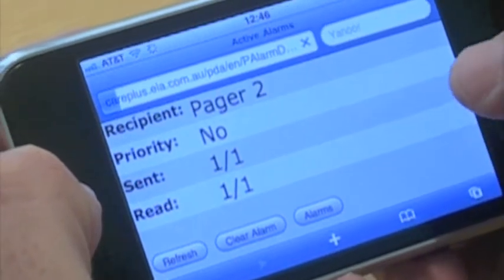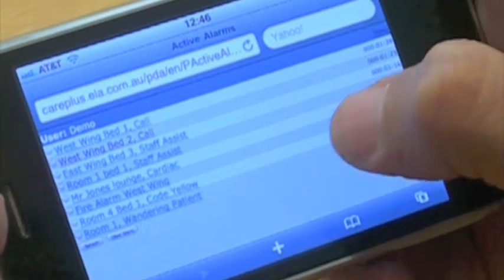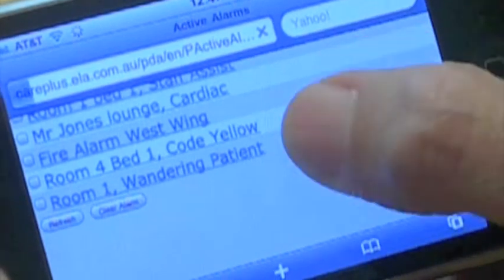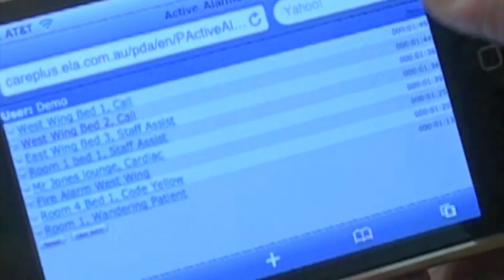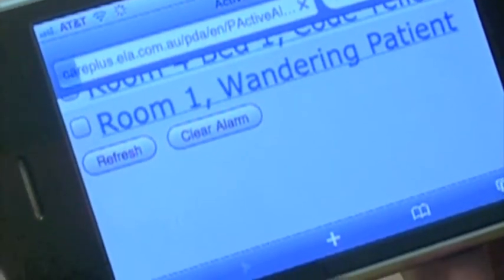Let's go back to the alarms page here on my smart device. I can still see all seven of those calls are still active, and now some have been active for almost two minutes. I might have a particular patient safety or patient satisfaction initiative and we might have targets for our nurses to meet all of their calls within three minutes. Pretty shortly I'm going to be able to tell by the elapsed time how my nurses are going, and I'll be able to see those calls being refreshed.